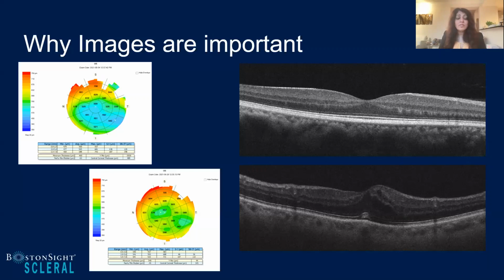And that initial corneal edema was able to be seen, yes, on the slit lamp, but I also had the ability to document and see how much of an elevation did I have in that cornea and how much swelling was taking place. So that way I could then continue to monitor and progress and watch as I was treating the cornea, was I returning the cornea back to normal? We solved the corneal edema, continued with our fit. A little while later, he started to have a decrease in vision again. And I went back and I looked, I'm like, the cornea is clear this time, what's going on? And thankfully I had baseline OCT images, and I rescanned his OCT and looked at his retina again. And then we started to deal with macular edema.